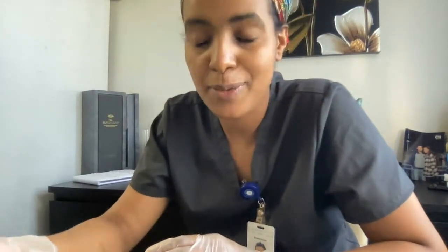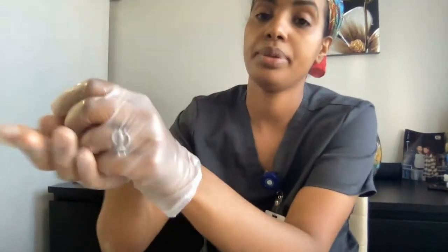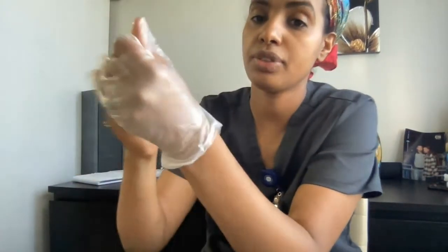We apply a gentle pat with gauze and apply a bandage if needed. We discard the needle in the sharps container and do not recap the needle.